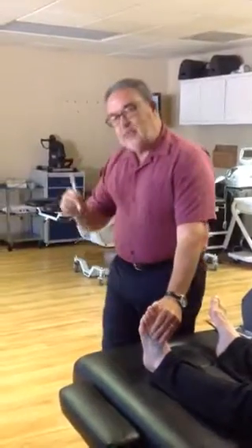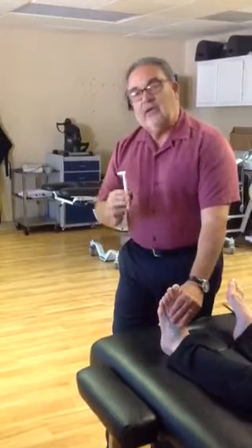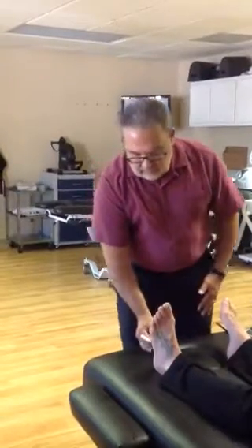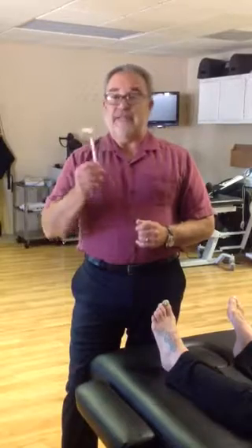The next thing we do is light touch. There's a little thread at the end of this — it's called a monofilament. If they can't feel this, they've lost the myelin sheath, and the myelin does not regenerate, so there's not a lot we can do to help them. There are about six points I hit on the foot. I tell the patient to close their eyes and I touch them with this very thin light touch thread and they tell me if and where they feel it. I measure whether they feel two out of six, four out of six, or six out of six. Most people pass this test, but a few don't — those are ones who've had severe injuries, cut nerves in surgery, or drop foot.